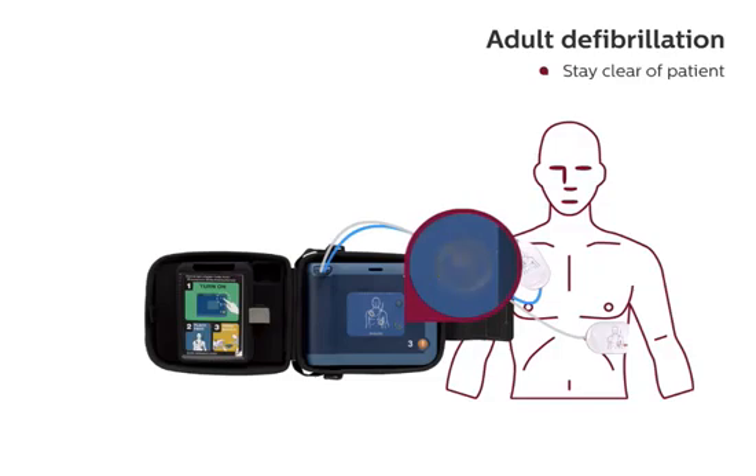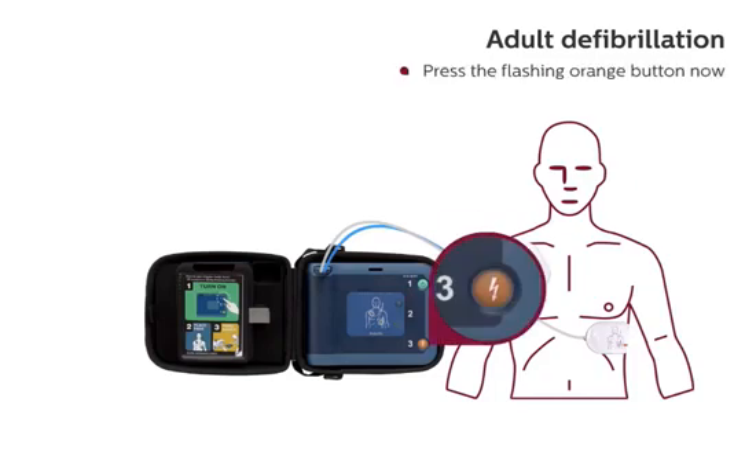Stay clear of patient. Analyzing heart rhythm. Stay clear of patient. Analyzing heart rhythm. Shock advised. Stay clear of patient. Press the flashing orange button now.